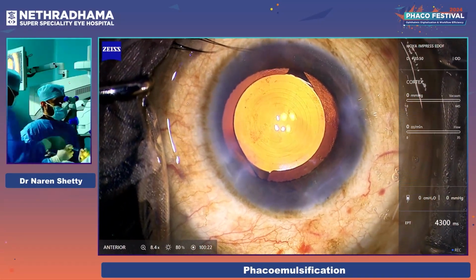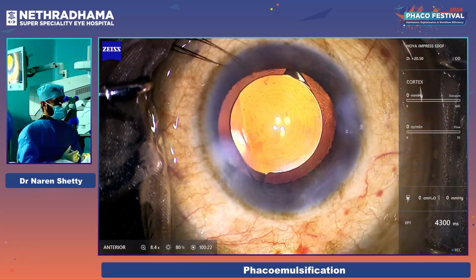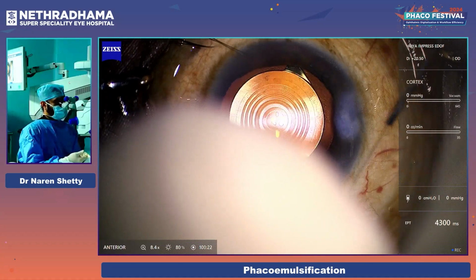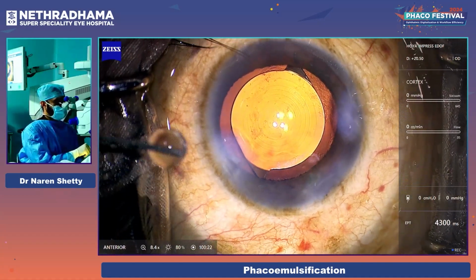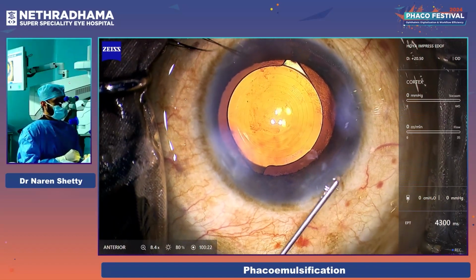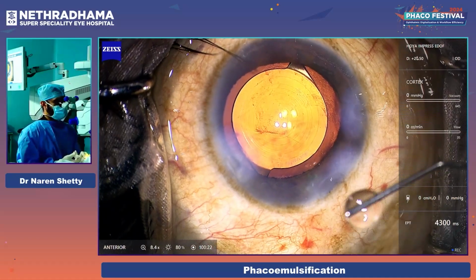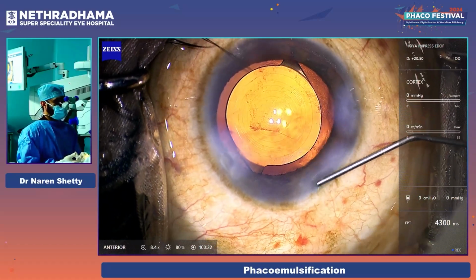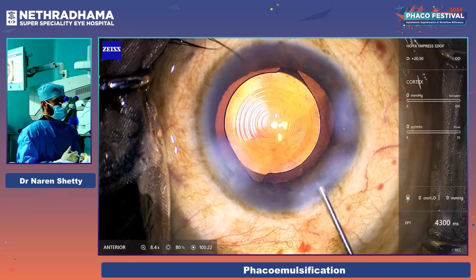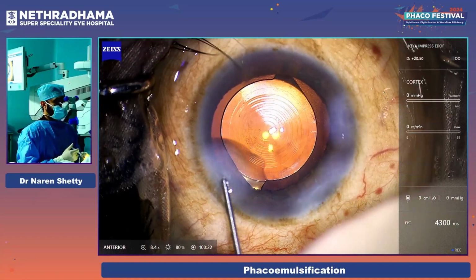I didn't want to do the femto chops because not everyone has a femtosecond cataract laser with them. But what I also wanted to show is a femto capsulorhexis, even in these kinds of hard cataracts. When you're trying to bring the pieces out, nothing happens. They're really good, very strong. And look at the centration. It is super, super beautifully centered, very useful in these kinds of premium lenses where the centration and the stability of the IOL is very, very important.